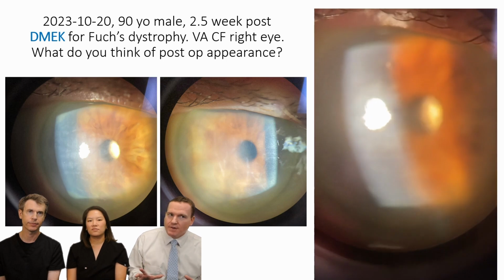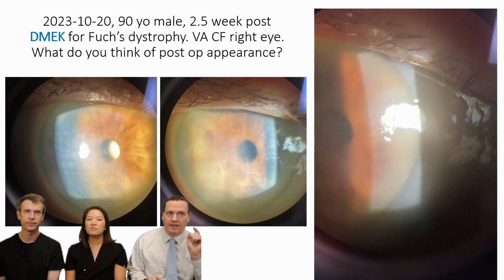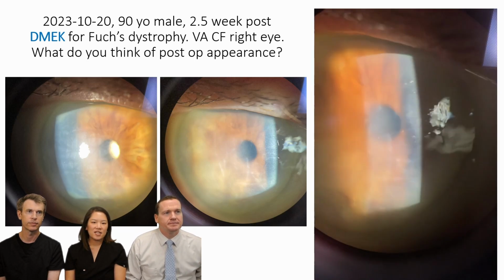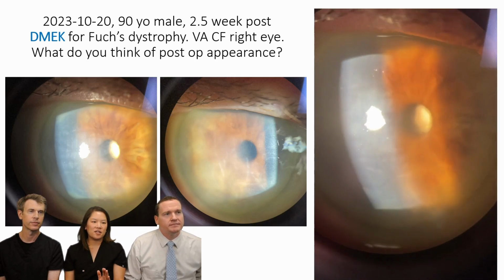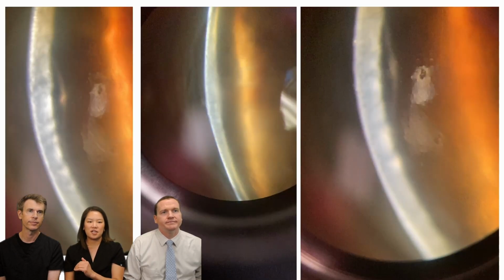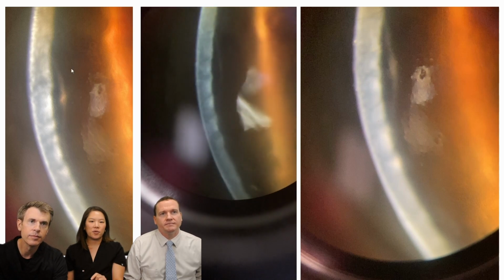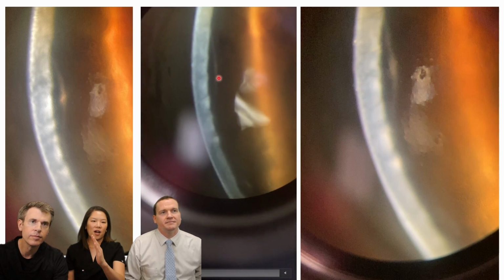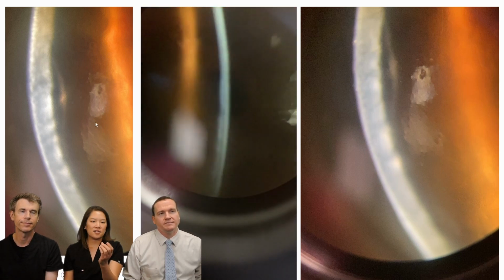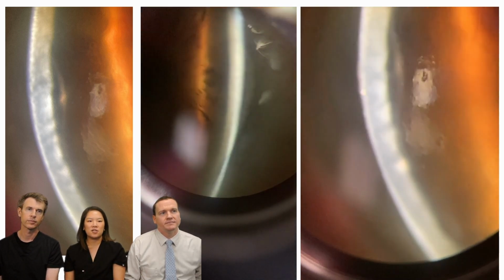Now, by 2.5 weeks after a DMEK, I would expect a little more clarity out of the cornea than what I'm seeing here. What do you think? Absolutely. It looks like there's an area that, and it's basically an indication that there is an area that is detached. You can definitely see it better if you do a wedge right there. You can see that little line posterior is actually that graft lifting off away from the stroma, and kind of isolated edema. So focal edema in an area really points to a detachment.